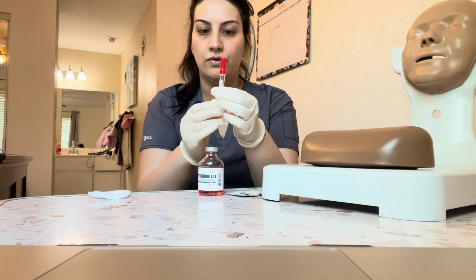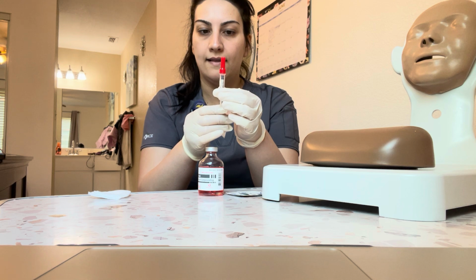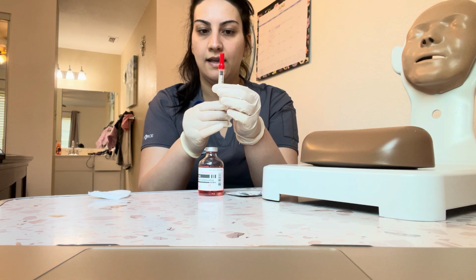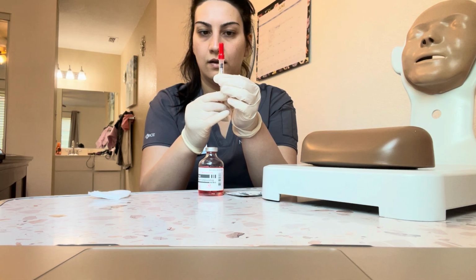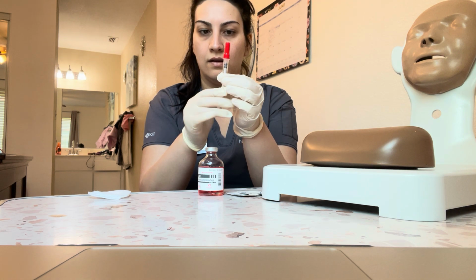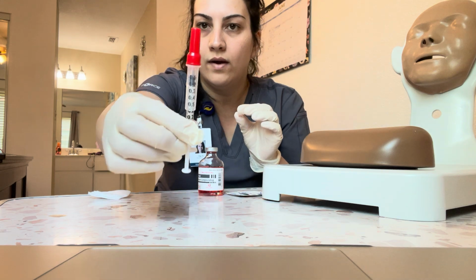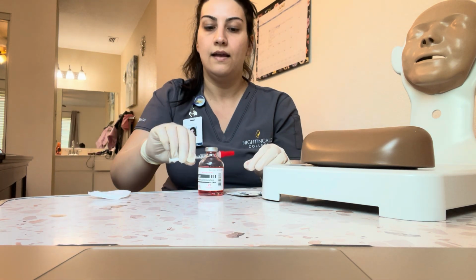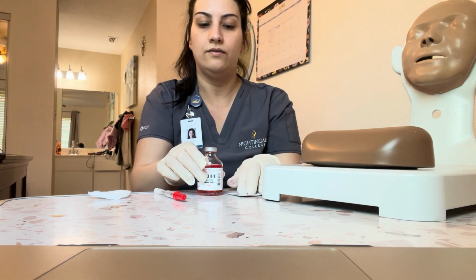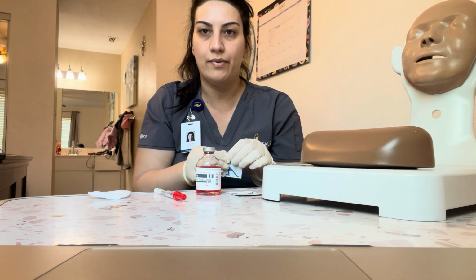We're going to draw up 0.1 milliliters of air here. Zero point 1 milliliters of air. You guys can see that. Awesome. Next, we're going to get this medication prepared.